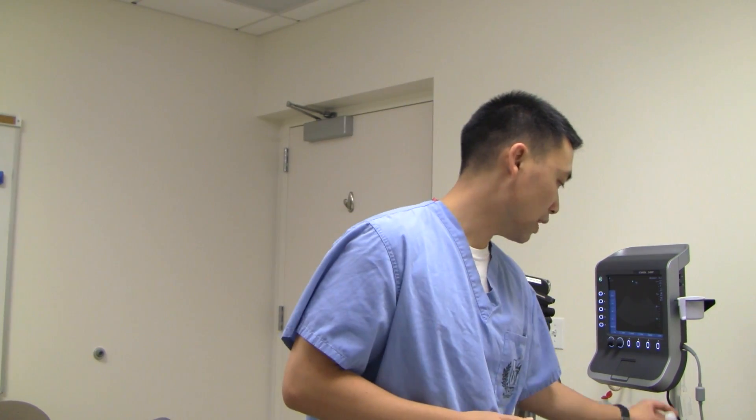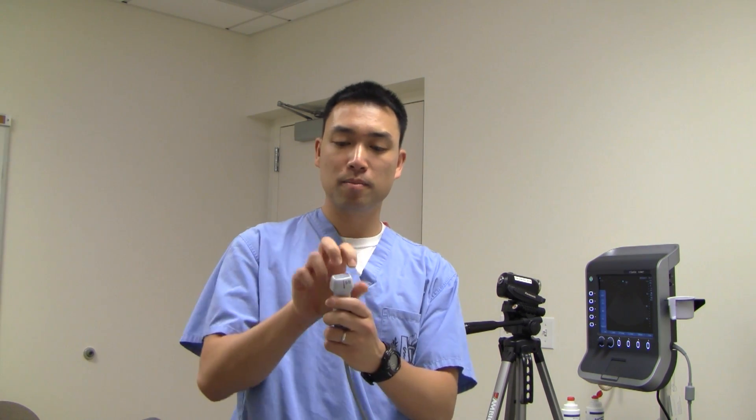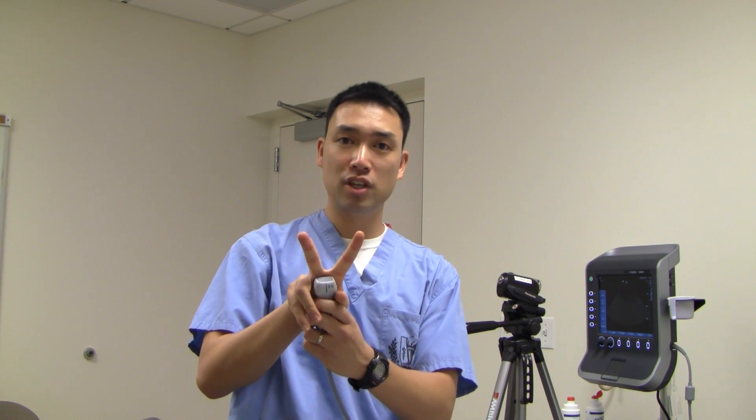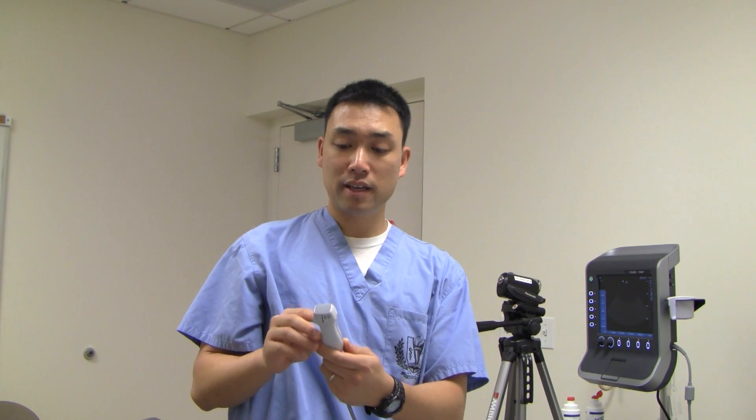What's different with the cardiac ultrasound we're going to be using today is this other probe — it's called the phased array probe. That's just a fancy term for a probe that branches out. You're going to see a V-shaped view on the screen, which I'll show you in a bit. It's a really low-frequency probe, so you can actually penetrate a lot deeper. For structures like the abdomen, kidneys, and heart, you're really going to want to use this phased array probe.